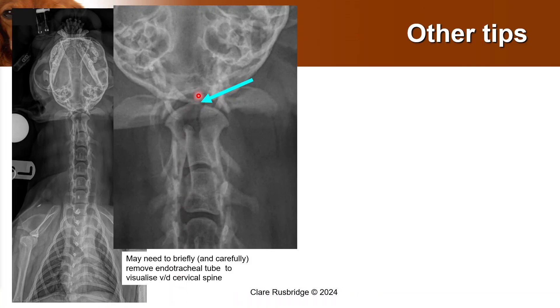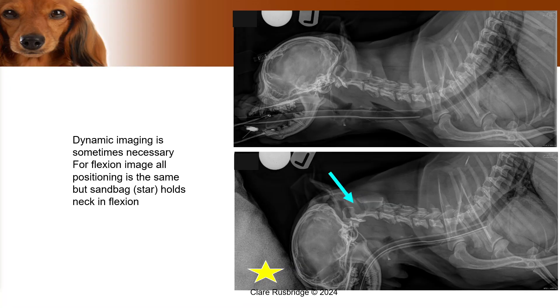And in the earlier image, what I forgot to point out is that this is a hypoplastic dens — it is a very, very small dens, and it would normally be much bigger than that. I hope that these tips have helped you when you're taking spinal radiographs in the future. Thank you very much.